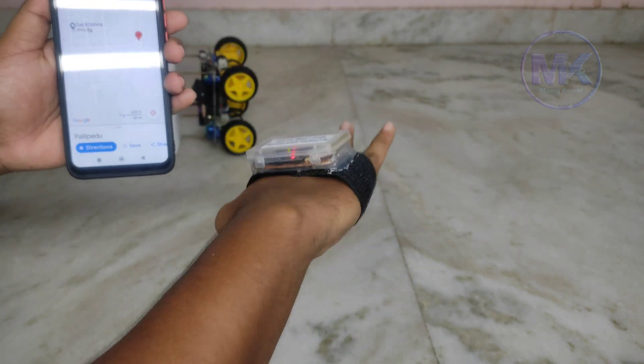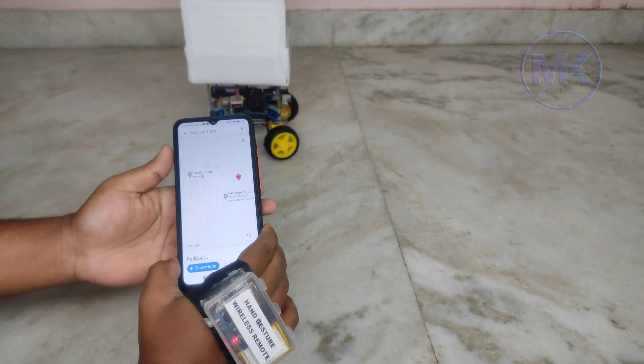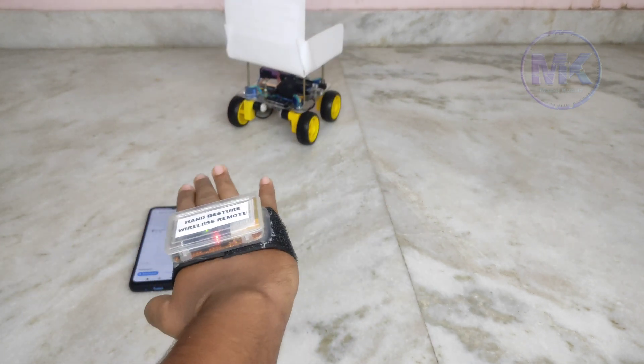When the wheelchair falls down, it will not respond to hand gestures until it is reverted back to its original position. When I put it back to its original position, the buzzer turns off and it is working normally.